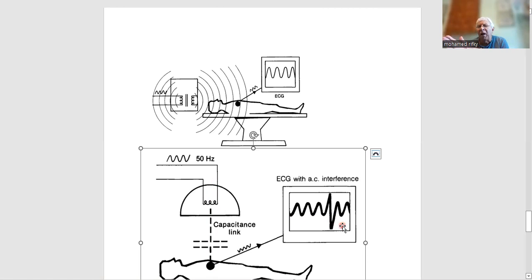And as we said before, how can we do what we call a screening? The screening simply means that I am applying something made, suppose, of a woven metal around the electrode. Electrode, as we know, is made of silver chloride metal and an adhesive device, and then we put around it this woven metal.